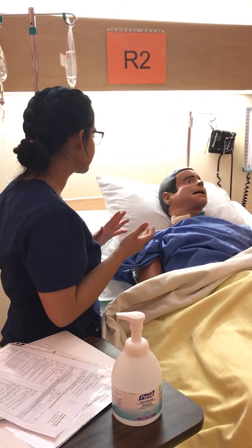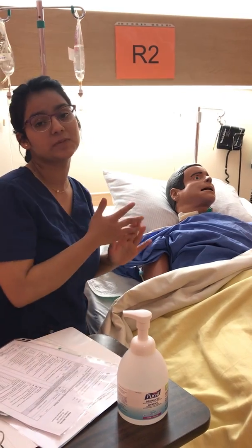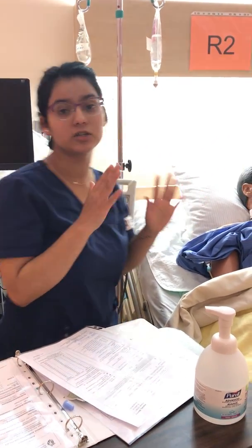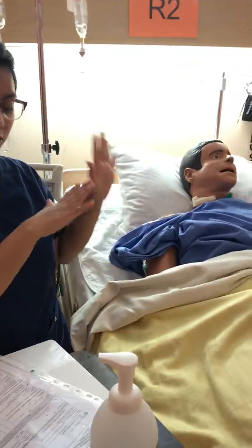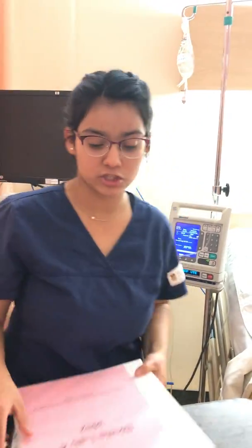Ms. Wendy, if you notice any lightheadedness, dizziness, or headache, please let me know and we'll take care of it. I'm also going to be monitoring her vital signs and watching for any signs of bleeding, because heparin can, as a side effect, make you bleed. So I'm going to document everything. Now that I'm done, we're going to move on to the chest tube dressing.